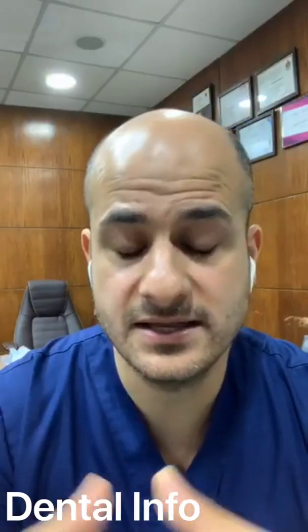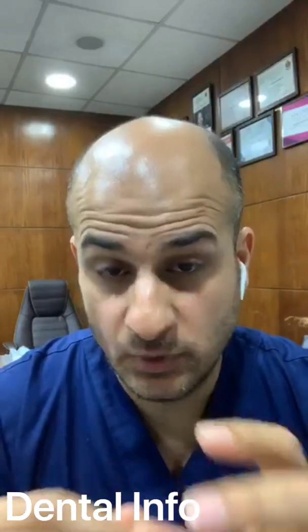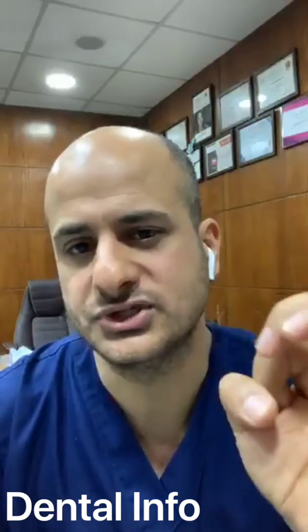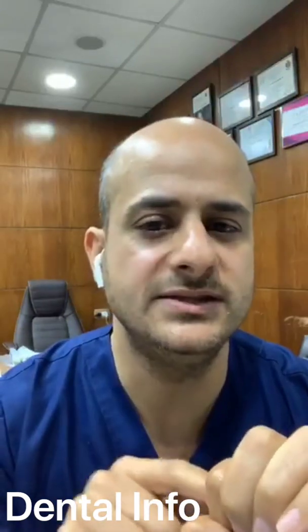That's a very good question too from Dr. Wei Jian. This question is somehow like Dr. Bisan's question about the squirting technique. He says, how can I obturate a C-shaped canal, for example, or irregular canals like oval canals with that? Okay, I will give you the answer here. We are lucky that we always have an apical constriction, and this is what we need to gain our tugback.